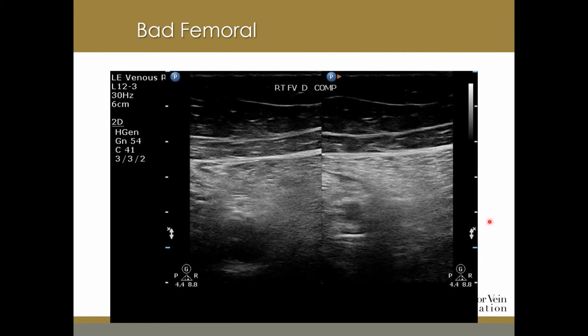The target would be to have a lower frequency probe and make adjustments to the TGCs so that there is more continuity of the grayscale aspect in this image, but also highlighting the area of interest, which is these femoral vessels located here.